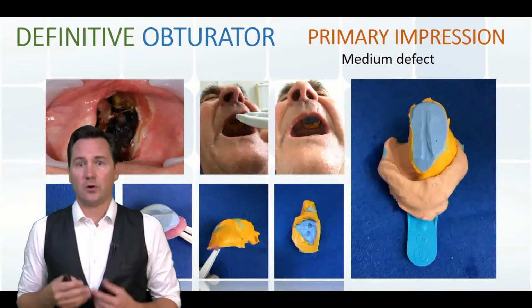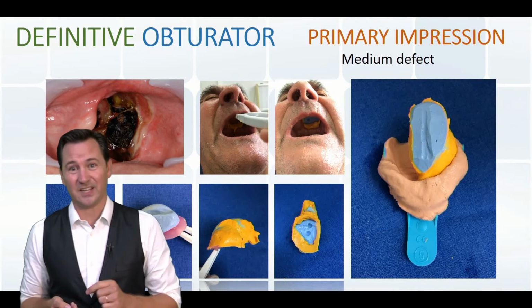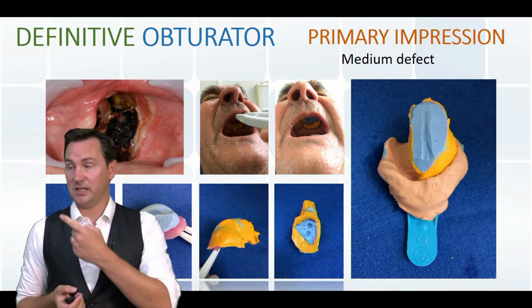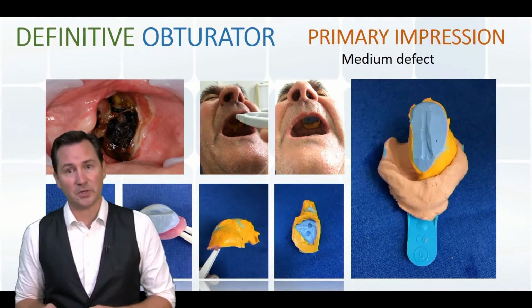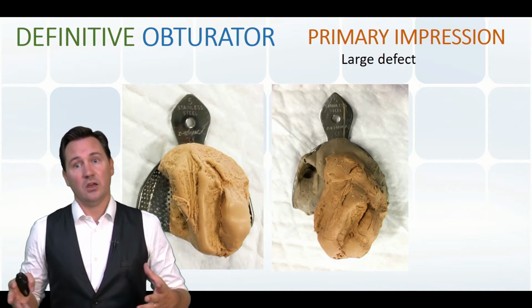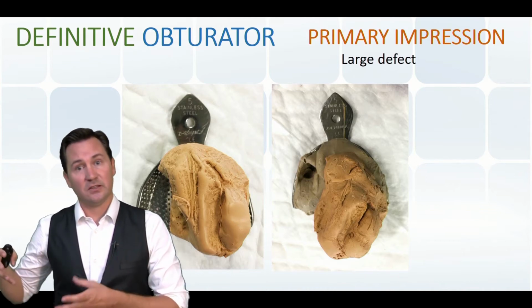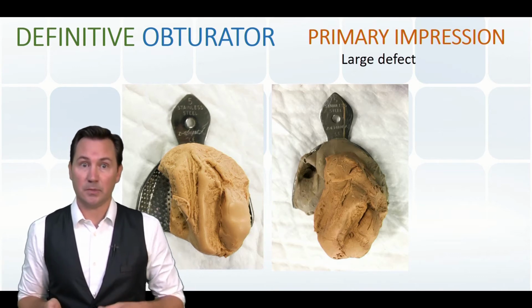The limitation for this is a bigger difficulty to record the continuity between the defect impression and the dental elements, as you can see here. But this can be useful for patients with limited mouth opening. But if mouth opening is not an issue, another solution is to take a VPS impression of the defect and then to use it again to do a wash impression using the same tray for the dental elements.